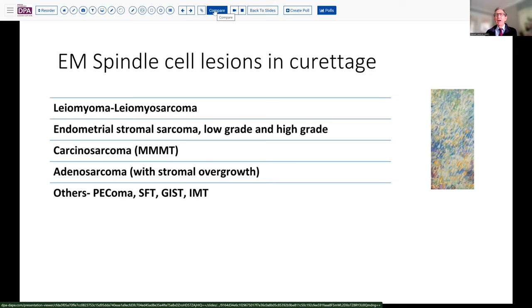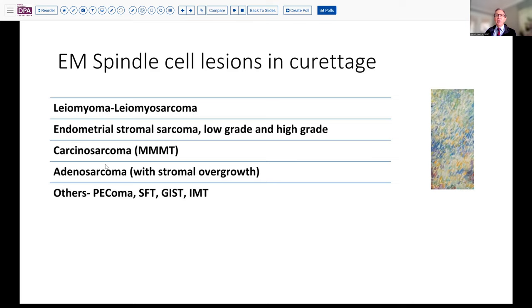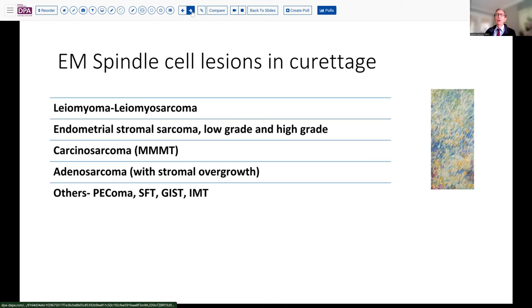Our preliminary evaluation looked at some of the possibilities. We did smooth muscle markers — those were negative. We did epithelial markers — those were negative. We did HMB-45, BCL-2, CD-34, DOG-1, CD-117, and ALK to consider some of these less common entities. But essentially, we had positive reactivity with CD-10, which was fairly helpful to put us towards an endometrial stromal sarcoma.